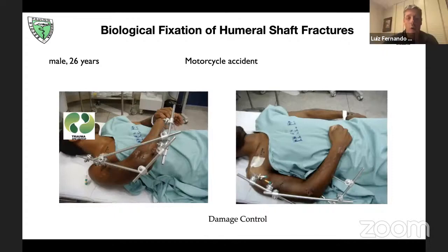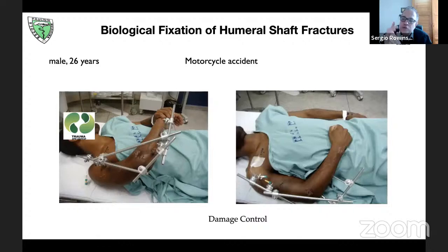All right. So absolutely right. Coco, all right. No, just a second. I said exactly that we should evaluate the size of the distal fragment, and a 3D CT can be a tool for us to see that. But what Dr. Belangero said is very important for the young surgeons to understand.